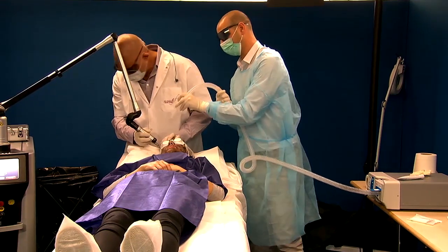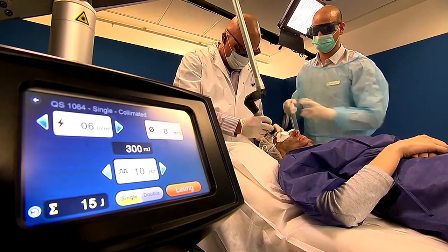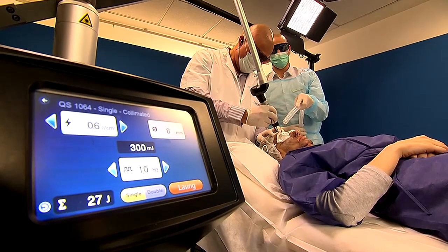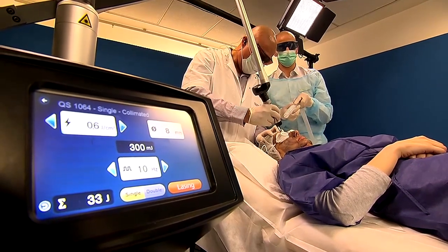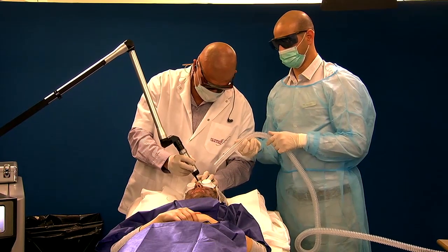As I said, the carbon is the target. Now we enter the second stage, and now you can see how the carbon evaporates because this is the target for the laser.